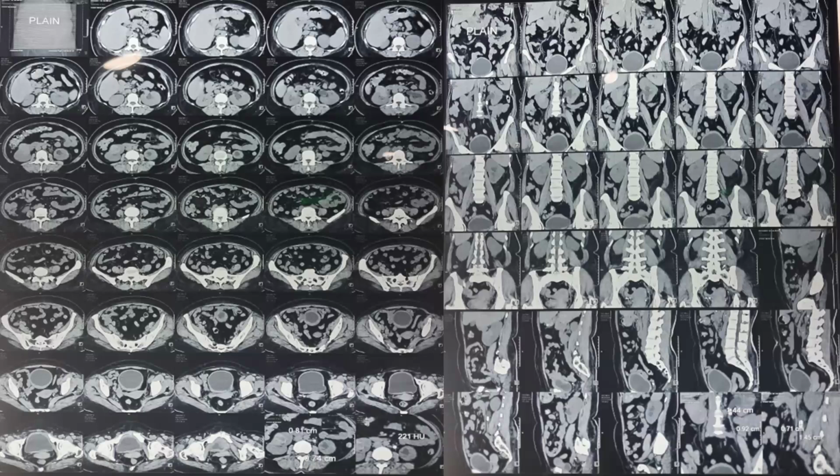So if we come to T stage, it should be tumor size and tumor site, involvement of the PCS system, involvement of renal sinus fat, involvement of vessels, presence of tumor thrombus and its level, and whether it extends to the Gerota fascia or not. So that is your T staging, right? Then presence of regional lymph nodes, enlargement or not, then renal vasculature, the numbers, the site and the course of the vessels. Then comes M staging and N staging, and the last is the status of the contralateral kidney. Right, so this is how you should see the CT scan in a patient having a renal mass.